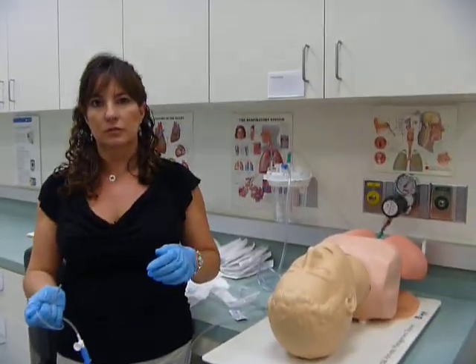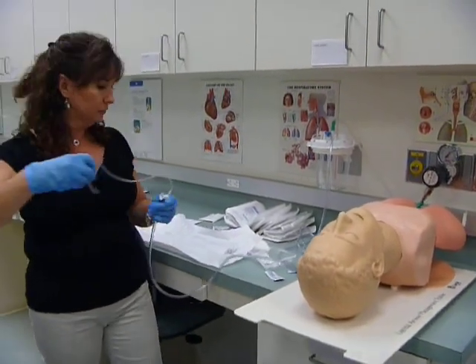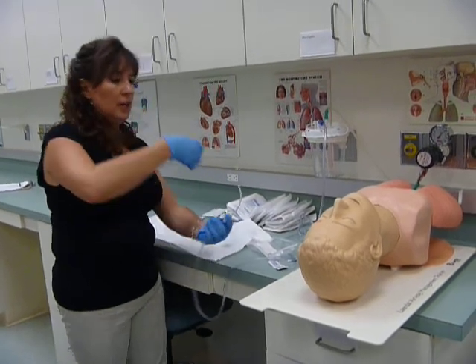And you should see it there too in the little canister how much you have suctioned. And it comes out green and brown, doesn't it? Well, it can. I've seen it. Or it could be green, it could be yellow.